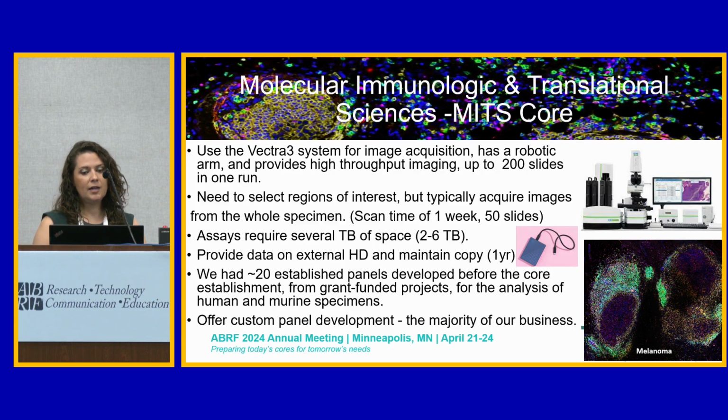And so scan times, it's not uncommon to take a week or more to get the 20x scanned images. And this also requires quite a bit of space. On average, a small assay would be 2 terabytes, but they can go all the way up to 6 terabytes. And because of this intense need for storage, we've been managing this by using external hard drives. So we usually provide the data to the investigator on an external hard drive, and we will make a copy of this data ourselves, and then we encourage them to back it up to a server and to additional hard drives for long-term storage.